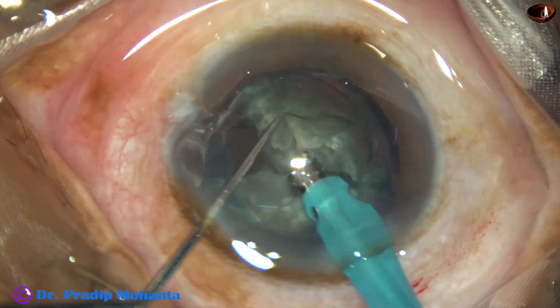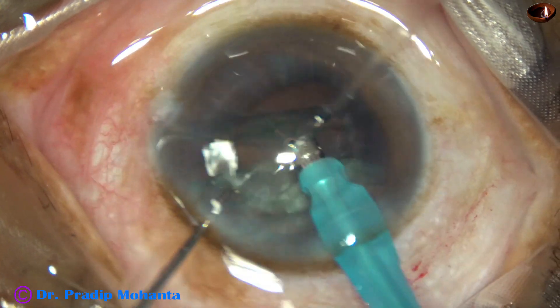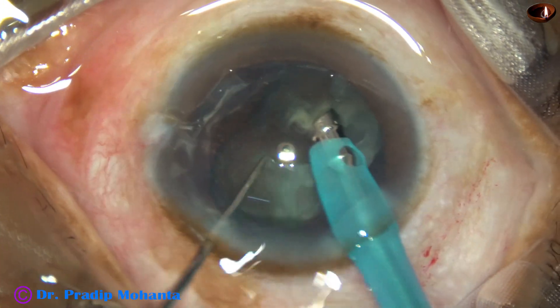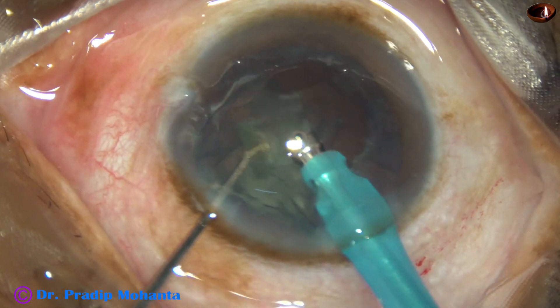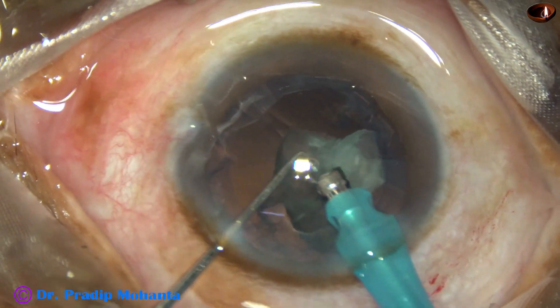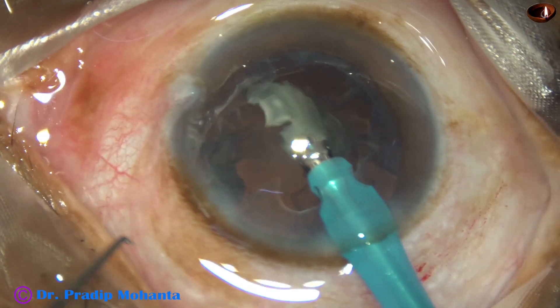Ultrasonic energy used is 60% in continuous mode, though most of the time 60% ultrasonic energy is not used. Use of ultrasonic energy is controlled by the foot switch. This is the last portion of the nucleus and it is emulsified safely.